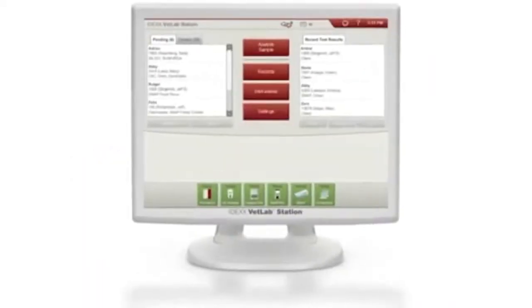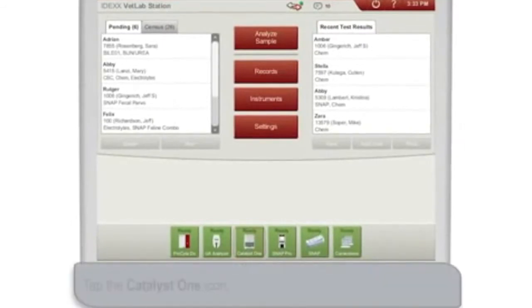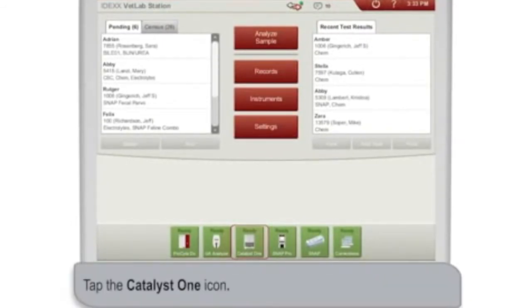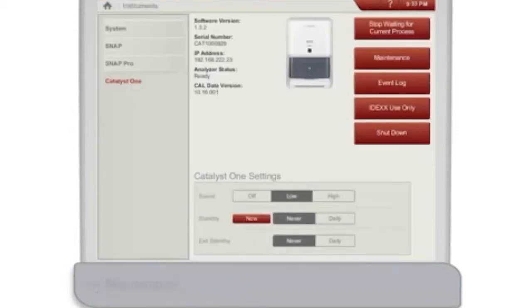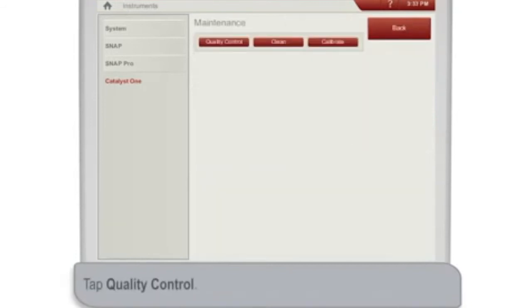Once the preliminary steps have been completed to initiate the QC run, tap the Catalyst 1 icon at the bottom of the IDEXX VetLab Station home screen. On the Catalyst 1 Instruments screen, tap Maintenance, and then on the Maintenance screen, tap Quality Control.